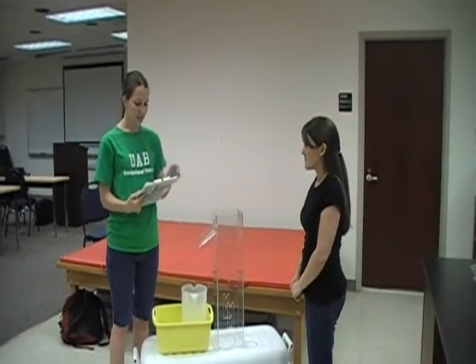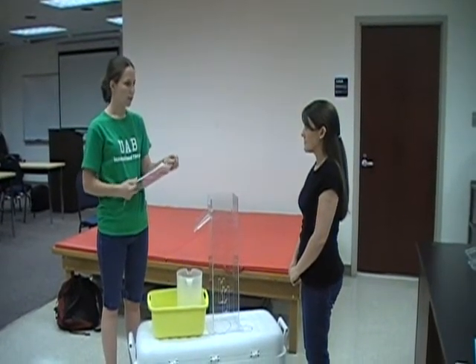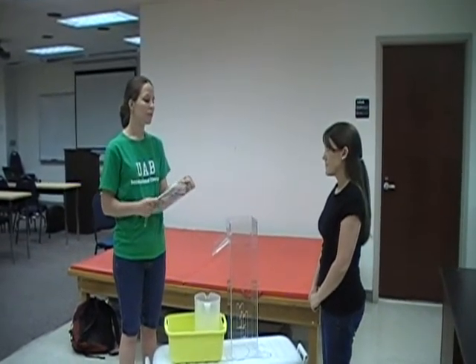Next we're going to do the volumeter, which is used to determine the amount of edema present. If there is only unilateral edema, you would compare the normal limb to the limb that was affected.